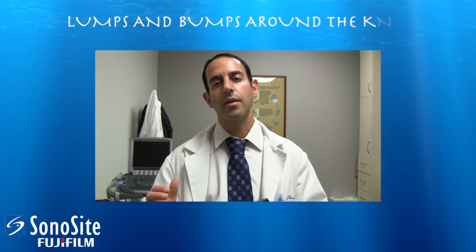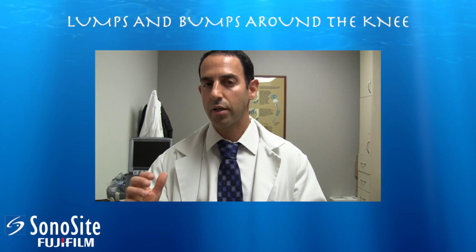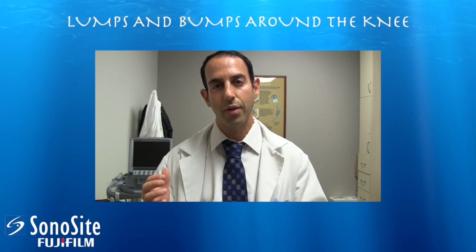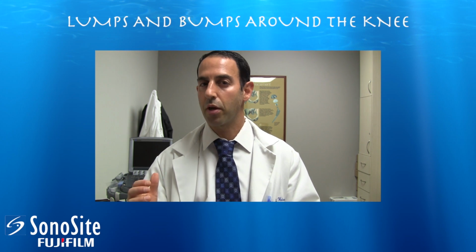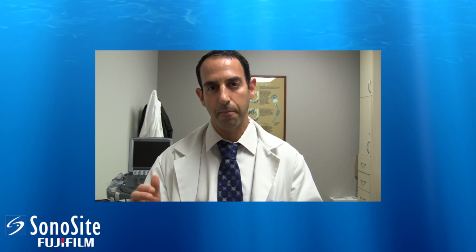In this next case, is somewhat an unusually high location for a Baker cyst. Once you get beyond or proximal to the knee joint, you're usually dealing with a ganglion around the semimembranosus tendon. But this case, I believe, is just a Baker cyst that is a little bit high up, has some loose bodies, and we're able to successfully drain it.